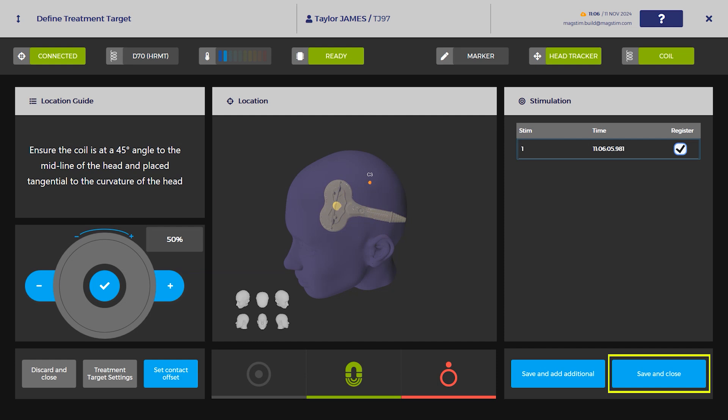Press Save and Close. Alternatively, additional targets can be added by selecting Save and Add Additional.